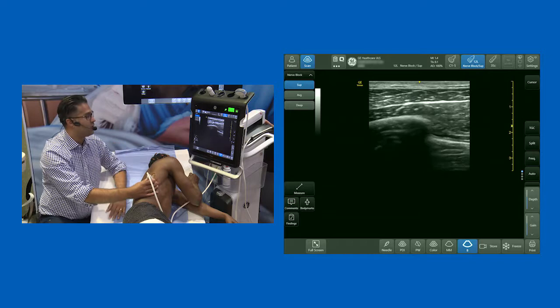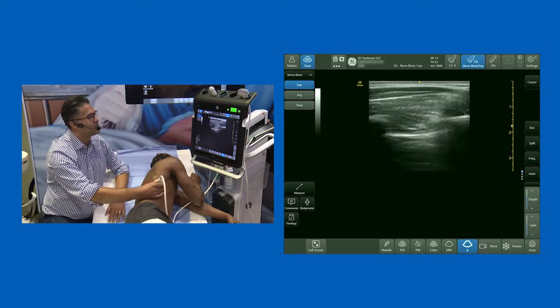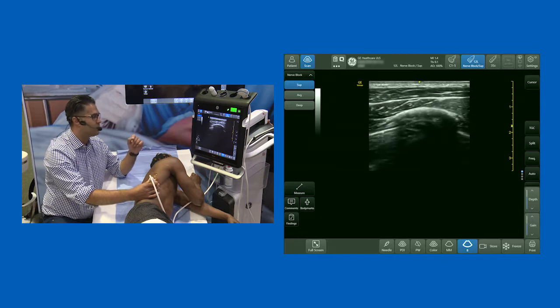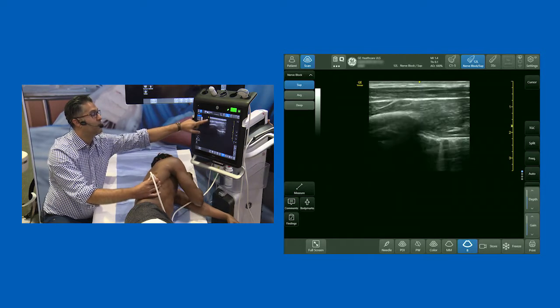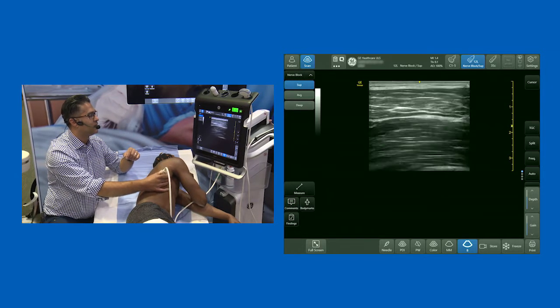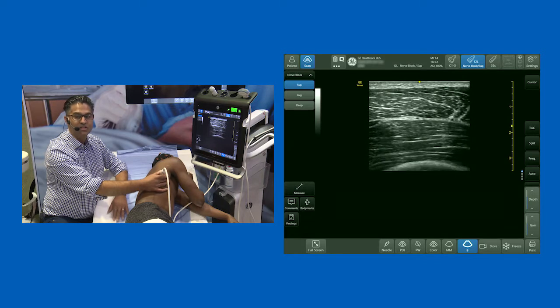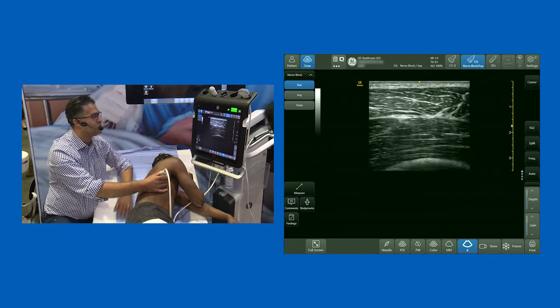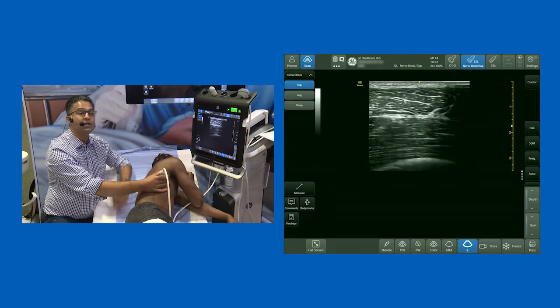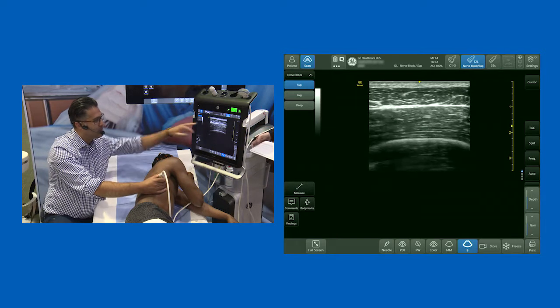So what's the process? I place the probe on the patient and identify the thick superficial muscle — that's LD. I want to see the anterior aspect of it petering out, and then the muscle you see there is serratus anterior. My sole purpose is to open up that plane between latissimus dorsi and serratus anterior. There is a structure that lies in that plane — the thoracodorsal artery, which you can see right in the center of the screen. It is a vascular plane, so the idea is not to inject local anesthetic into it. The thoracodorsal nerve is lying right next to it. The main purpose is to open up that plane and hydro-dissect your local anesthetic between the two muscles.